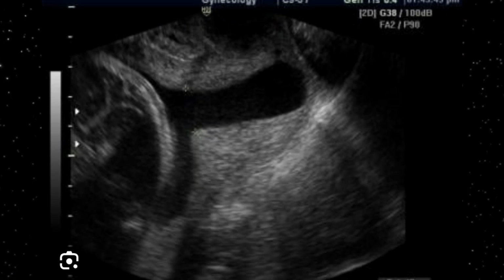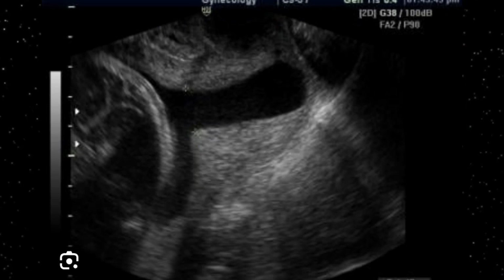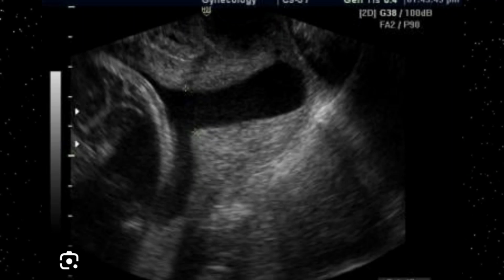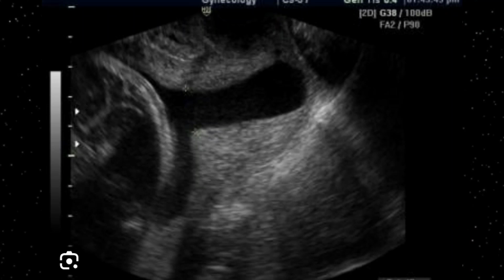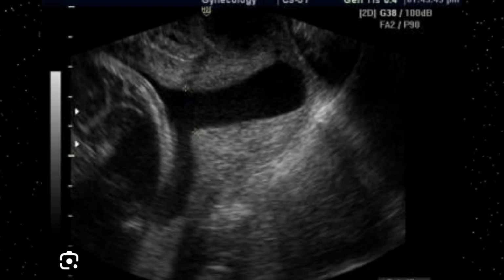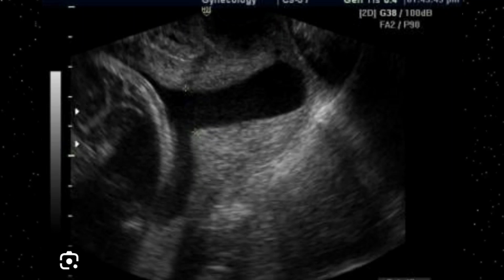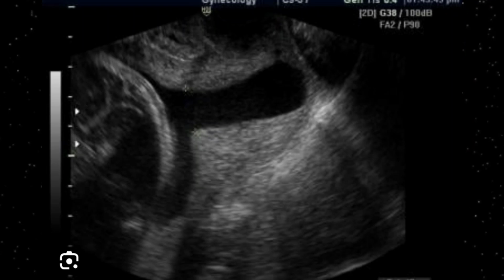In this cervical incompetence, you can appreciate the fetal head, which is clearly visible. Beside this, amniotic fluid is visible, and you can see the amniotic fluid has gravitated through the internal os until the external os. Here the internal os diameter, the internal os width, is much greater than 4 millimeter.